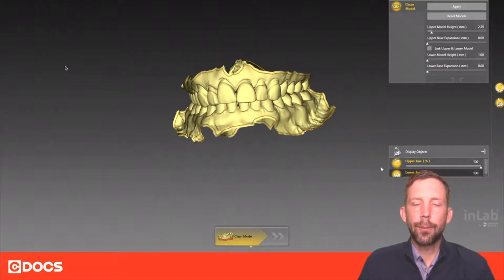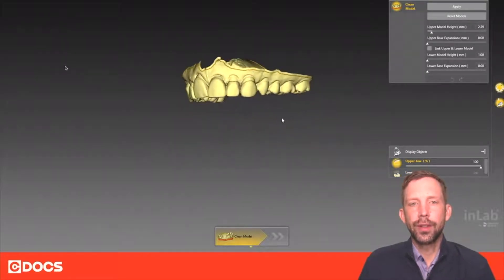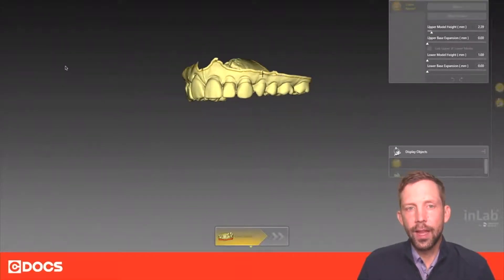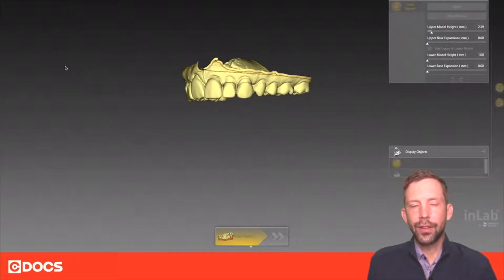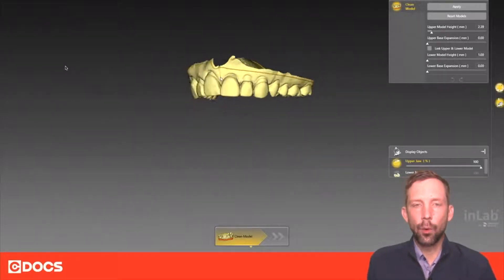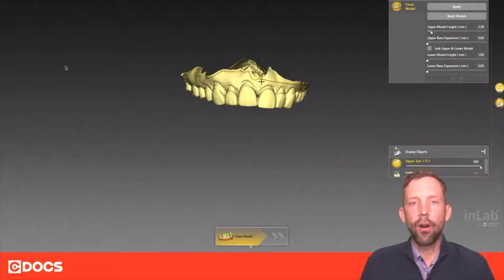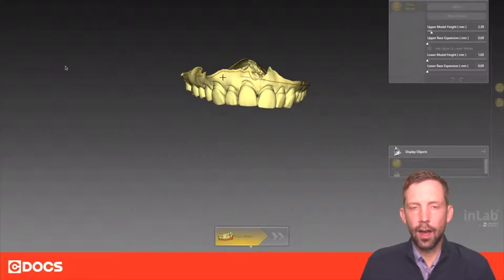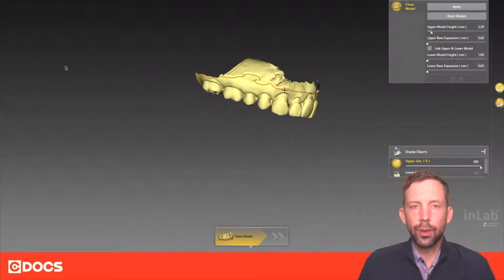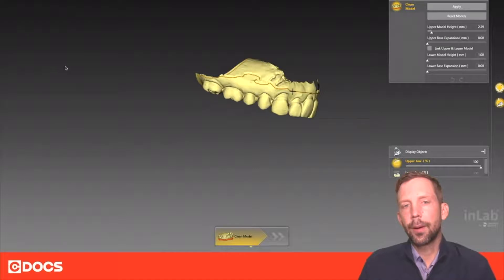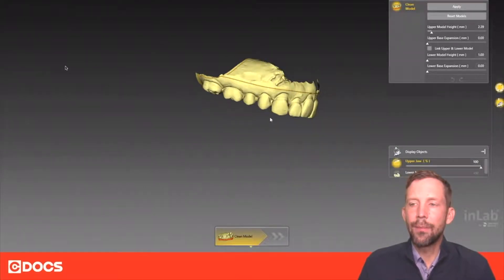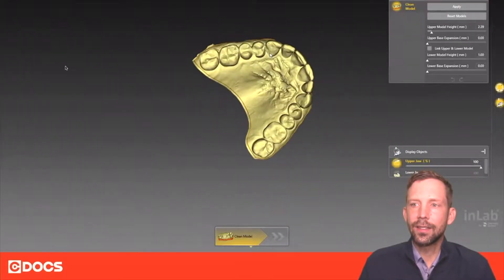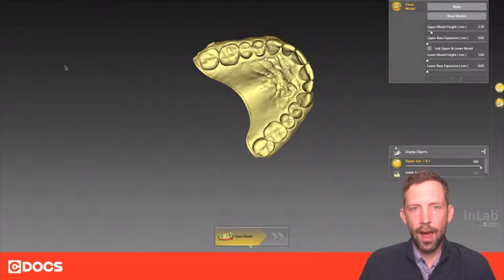I'm just going to clean the upper model to show you as an example of what you do. When you clean the model we're going to draw this line in a way to cut out all the extraneous material from our scan, from the prime scan. We're going to go all the way around this upper arch, kind of cut out this extraneous material and make this line nice and straight so we can get a beautiful model.